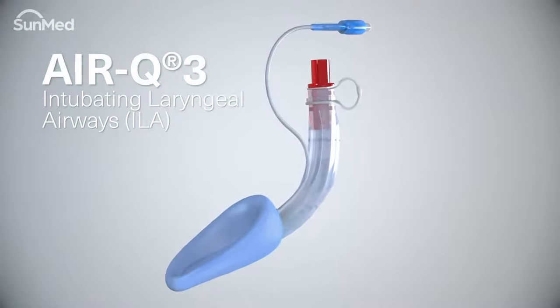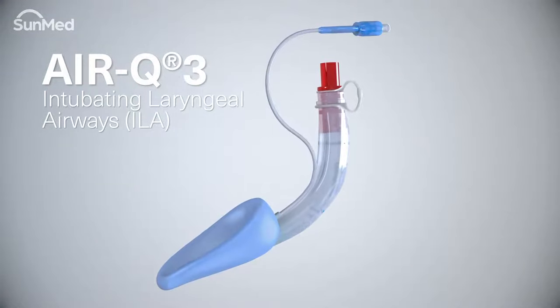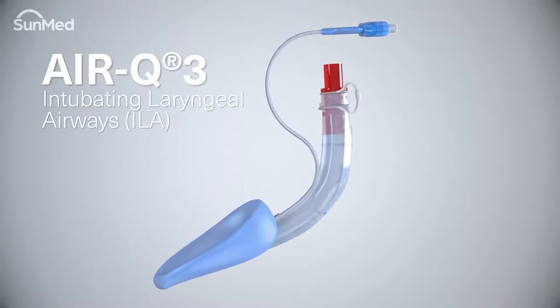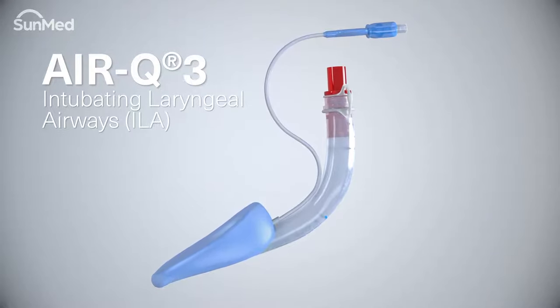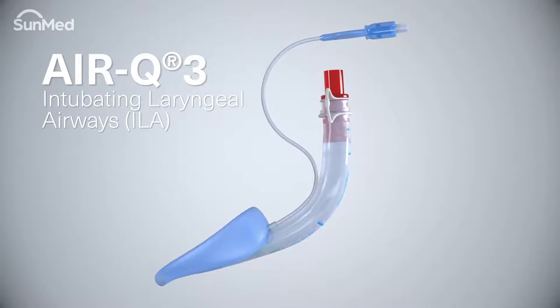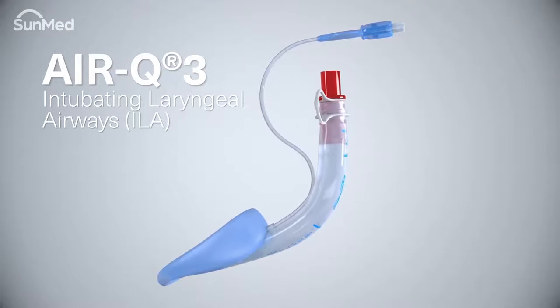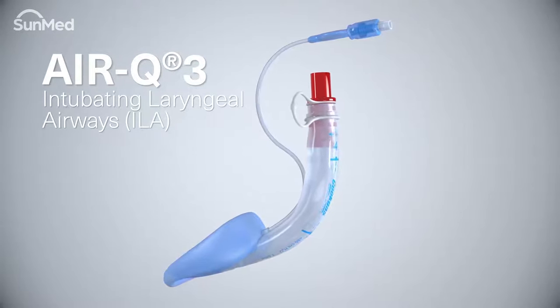The all-silicon air Q3 and air Q3 gastric intubating laryngeal airways are designed with ease of use and patient safety in mind. The air Q3 airways are indicated as a primary airway in applications which do not require an endotracheal tube. It is also especially suited as an aid for intubation in difficult airway situations when an endotracheal tube is desired.